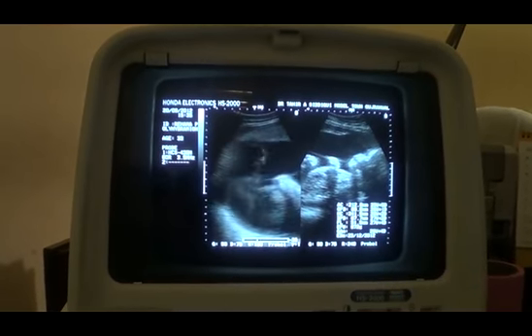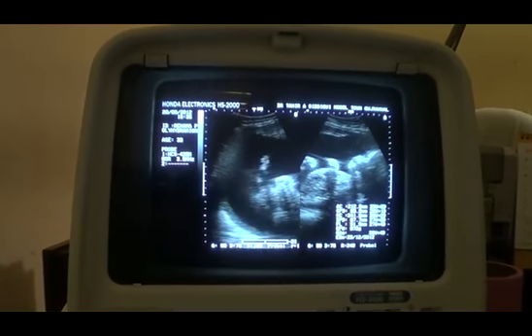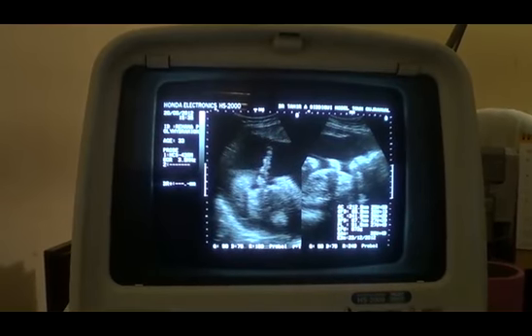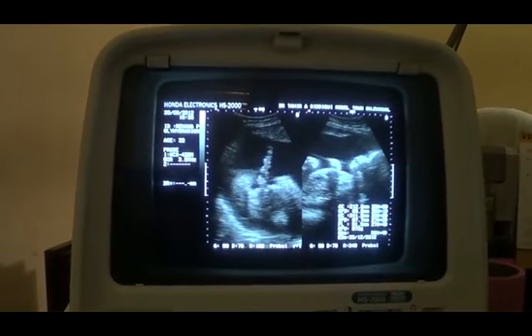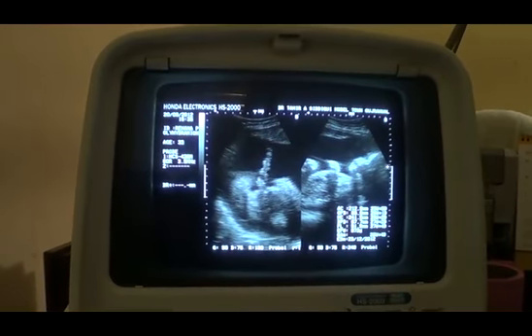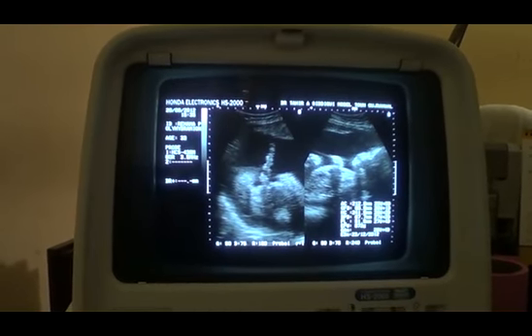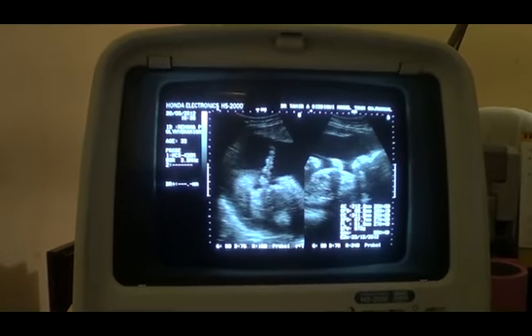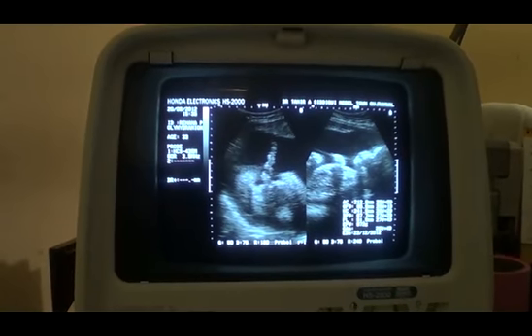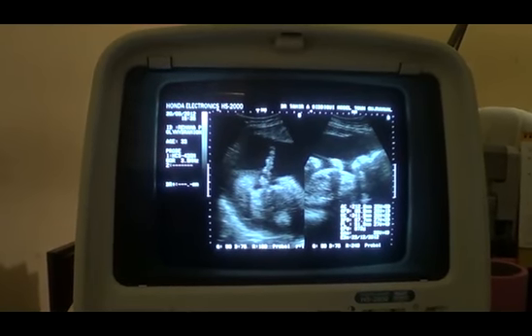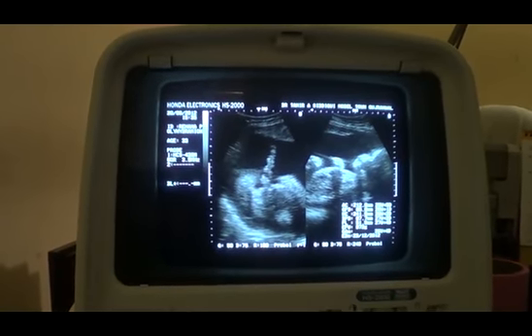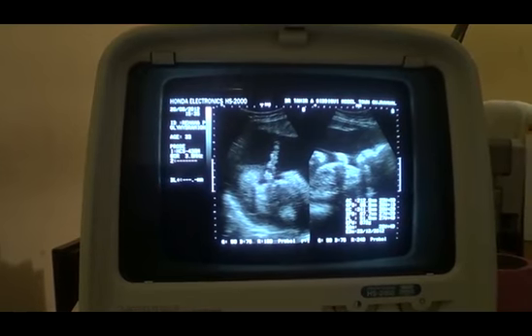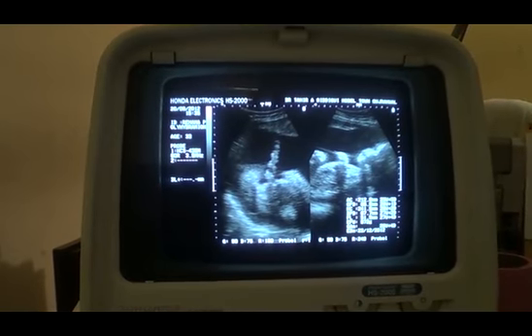This is the face of the fetus, the head of the fetus — this is the face, eye, mouth, body, limb. This is the body, this is the umbilical part, this is the cord insertion. Thank you very much.